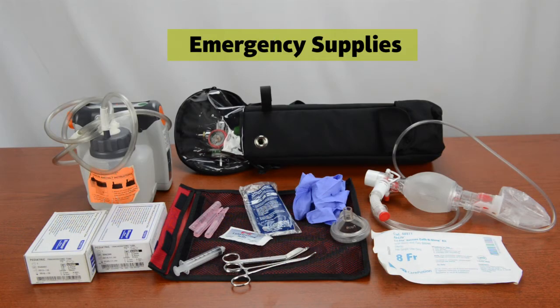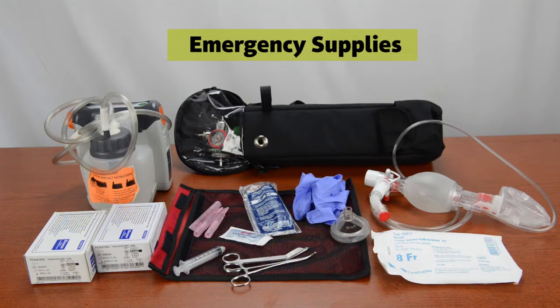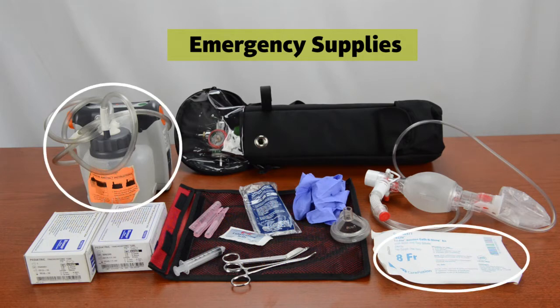When caring for a patient with a trach tube, the caregiver must always have emergency supplies on hand. These are a resuscitation bag and mask, an oxygen tank, an extra trach tube and downsized trach tube, and a suction machine and suction catheters.